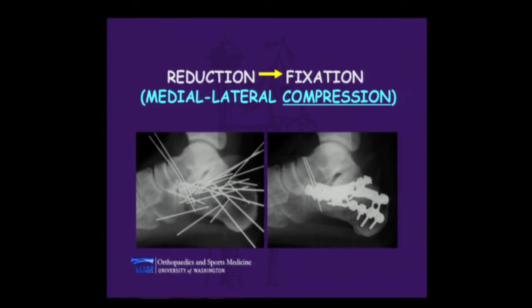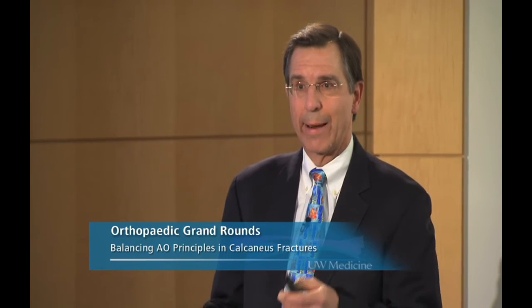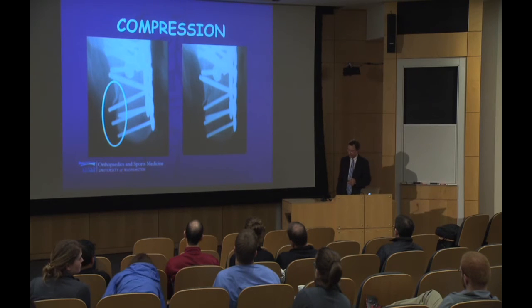By fixing the alignment of the foot and reducing the joint surfaces, you then have to provide medial to lateral compression, and that's afforded by the plate. When you actually compress this fracture, as Tom Rudy did with pilon fractures, we compress enough to restore the width of the heel, so that screws that you initially think are of the right length are actually too long and have to be shortened.